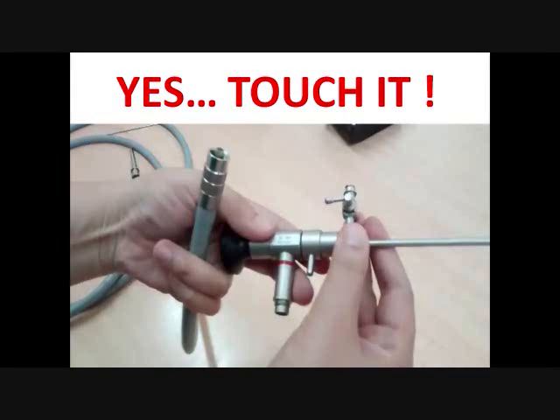However, if you have a hysteroscope equipment at hospital or at your office, just go ahead and touch it, starting from tomorrow. Even if it's different from the one I use here in this demo. Get it out, watch it, and touch it. You'll see that the general principles are the same. Besides, you should never depend on anyone to prepare and assemble the equipment for you, not even your room nurse. You have to know how to prepare and assemble the equipment yourself.